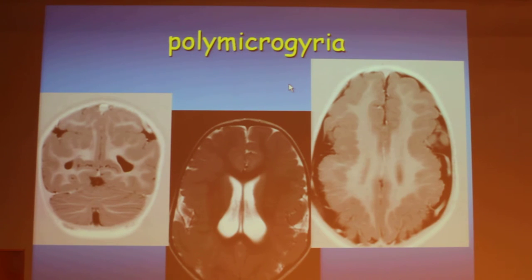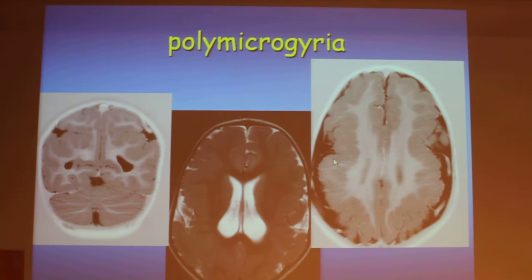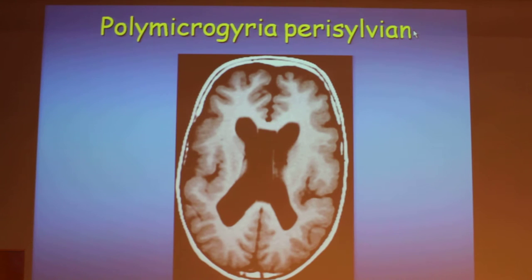Sometimes it's not easy to appreciate because it looks like a very thick gray matter cortex, but if we look closely into it, we'll see that it is composed of many small gyrations. It can be perisylvian — in this case, it's perisylvian polymicrogyria.